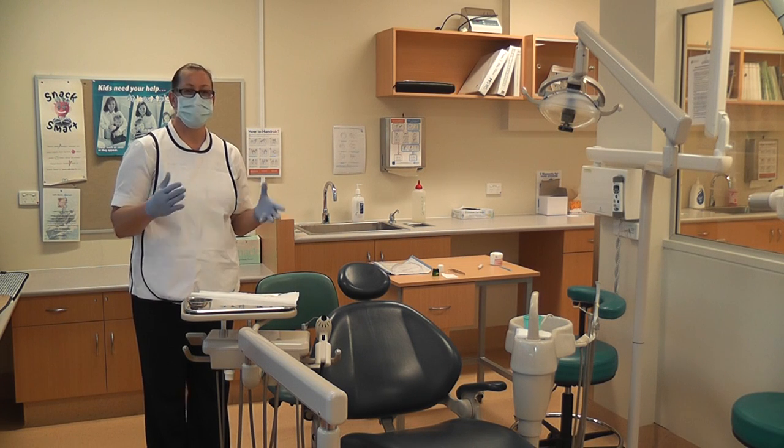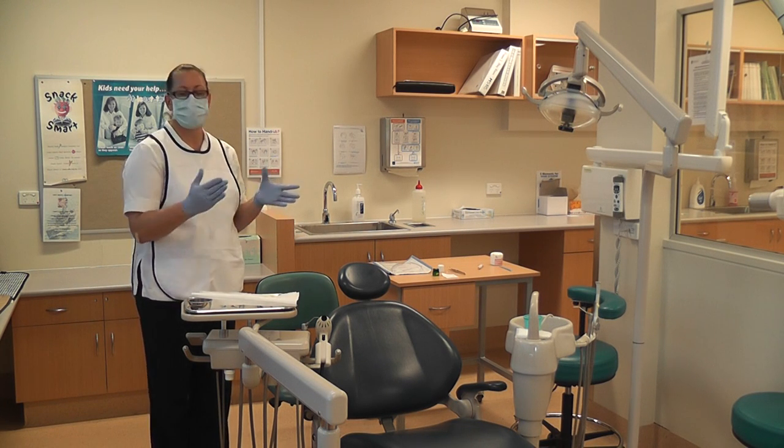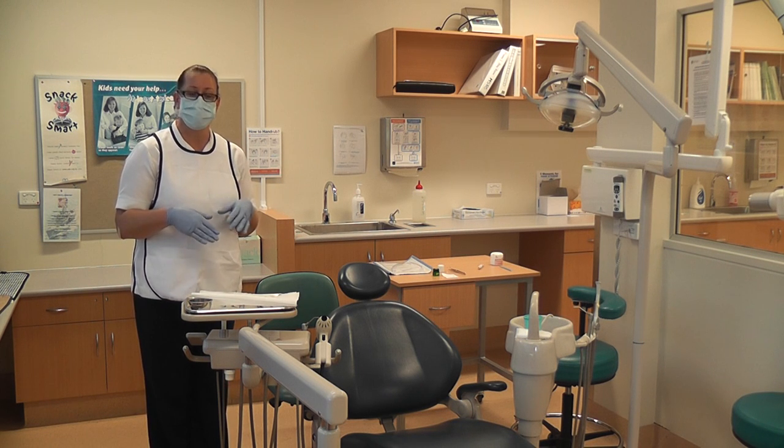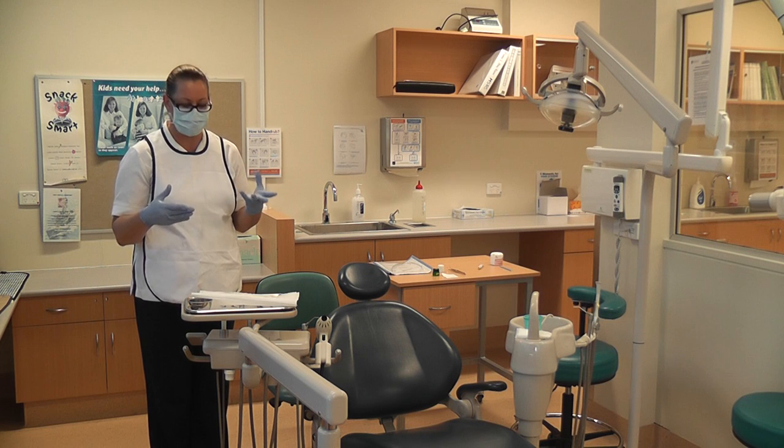So I'm about to show you the clearaway. The patient has just left our scale and clean appointment and it's our job now to clear away all of the dirty instruments and waste that we used in the procedure.